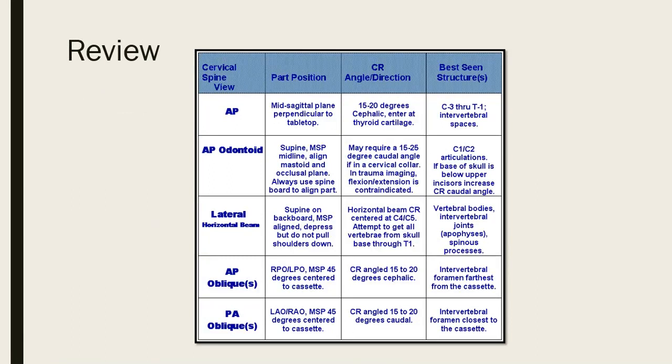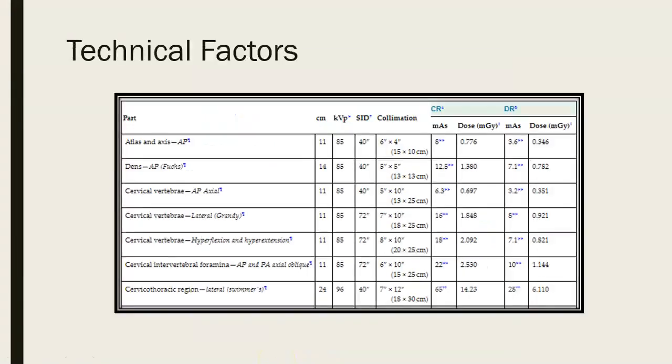So this is just a little review chart here that you can take a look at to help you study for your exam. It has each view on here, the part position, central ray angle and direction, and best seen structures for each individual projection. And all of the actual views or projections that we went over in these videos will be on your competency, which we'll go over also in the lab.